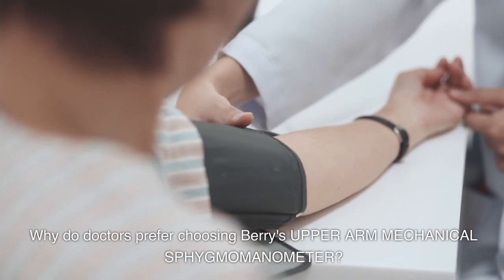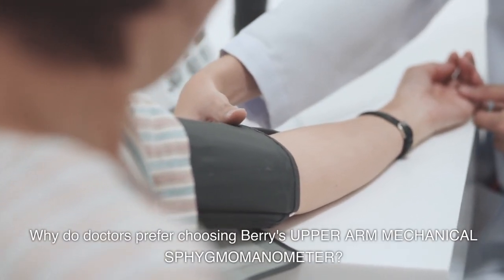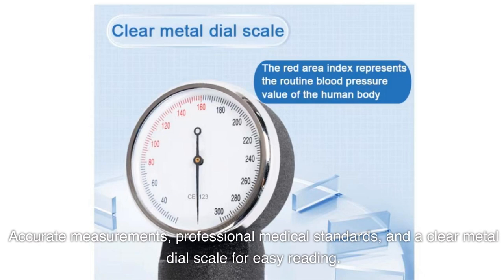Why do doctors prefer choosing Berry's Upper Arm Mechanical Sphygmomanometer? Accurate measurements, professional medical standards, and a clear metal dial scale for easy reading.